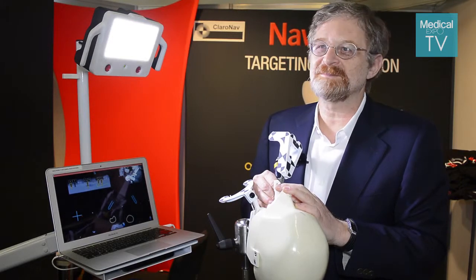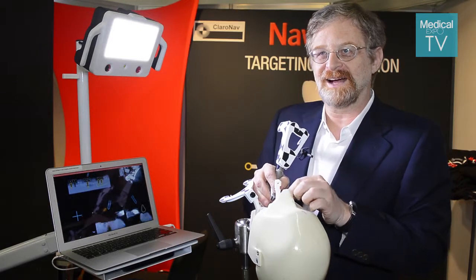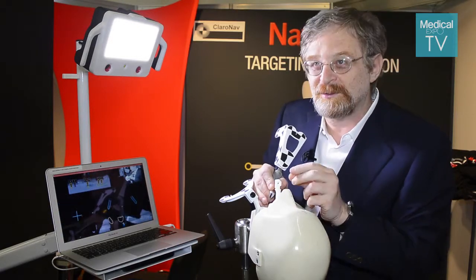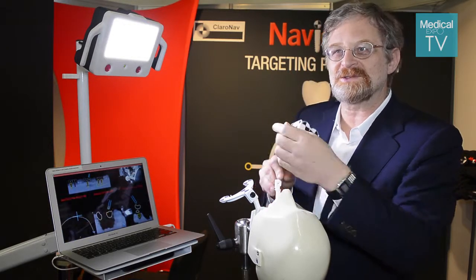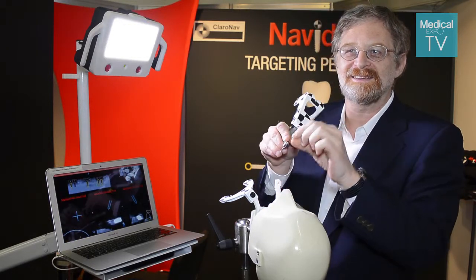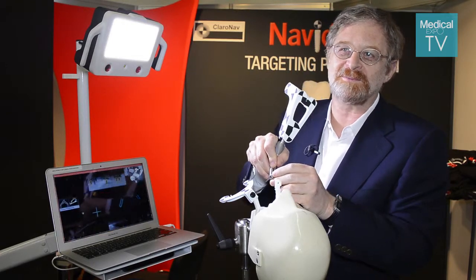It requires some training because it requires a change in the way they work. Currently they have to cut the gums, raise the gums, and then look at the bone very carefully while they drill. In our case they just look at the screen — the screen guides them to place the tip of the drill at the entry point, then change the angle to the right angle, and then drill to the depth.